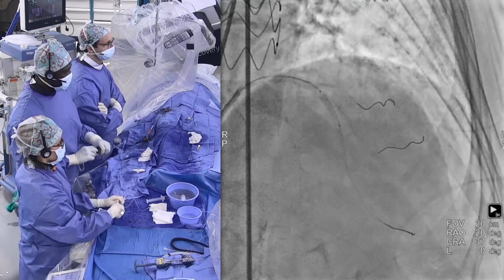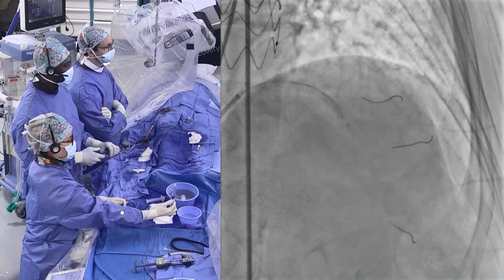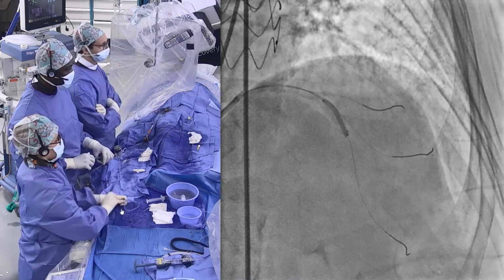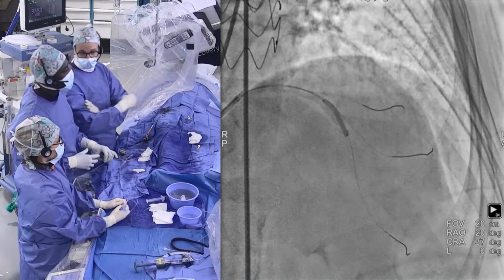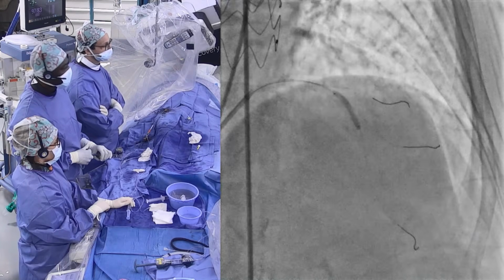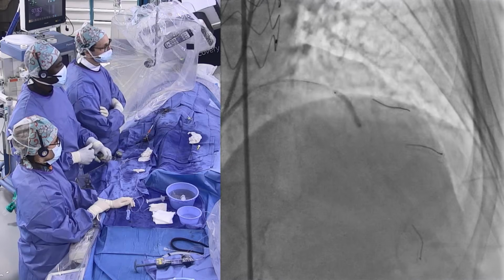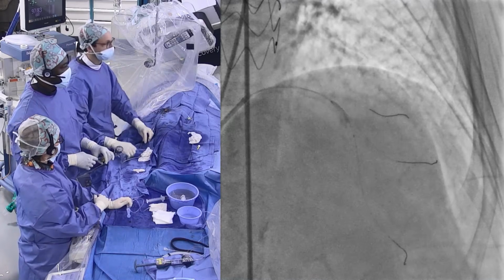Okay, let's go back to Toulouse and see how they proceeded with their case. Okay, here we are. We can identify the spasm more distally, but let's prepare the lesion of interest. So it's a 3.0/20 non-compliant balloon. And you can appreciate that there is no indentation, maybe a slight indentation just in front of the ostium of the diagonal. 18 atmospheres. 3 millimeters is at least the diameter. Yeah. And probably, Didier, we would have to improve to 3.5 between the two diagonals and more, 4, in the proximal part.